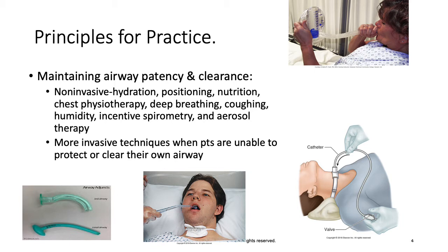And then the device that's below the oral airway is a nasal airway. So this would go into the nose and down to the pharynx to keep the airway open. And those can be used in semi-conscious patients.